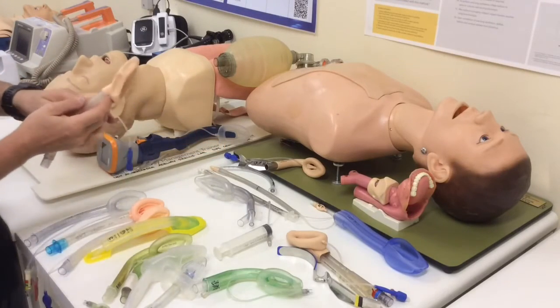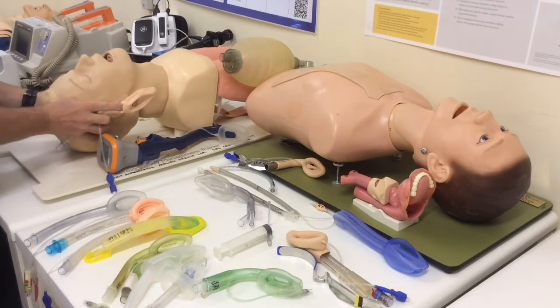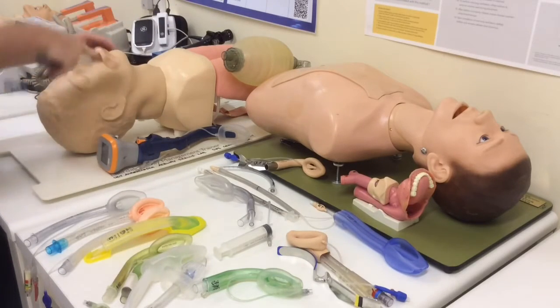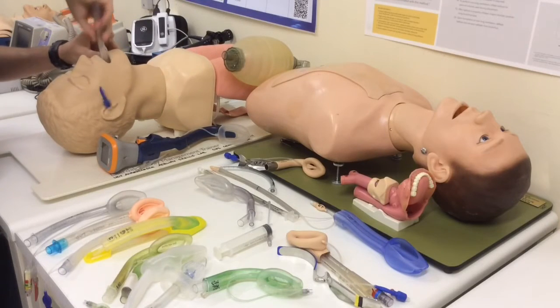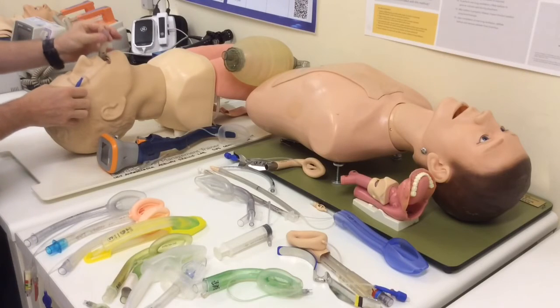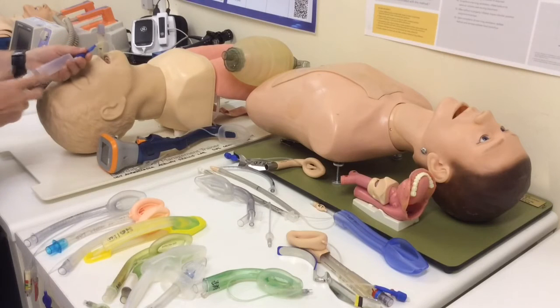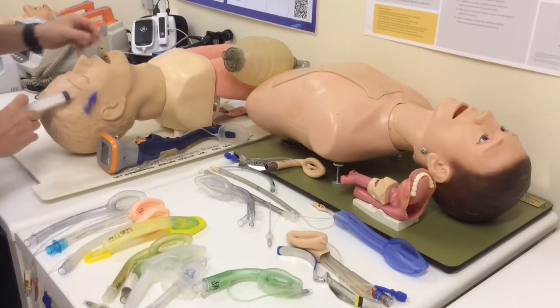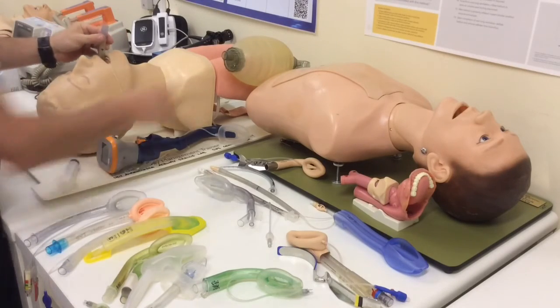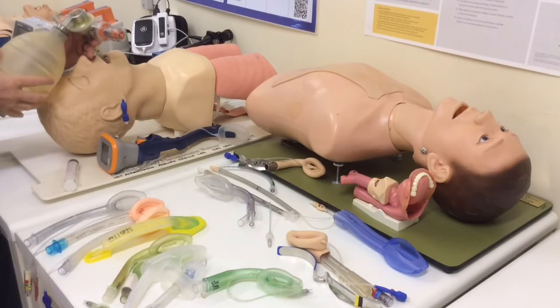And then the very classic technique is with the patient obviously fully obtunded, so either entirely unconscious and unresponsive or using some sedation and perhaps paralysis. You're going to use your finger as an inserter, lift the jaw, insert the device and advance it until it seats itself. I often use a bobbing motion, and you can feel that it's slipped into its anatomical seating. Then inflate the cuff. Sometimes you can see the device rise ever so slightly as it moves into the correct position, and then you can connect your ventilation source and ventilate your patient.